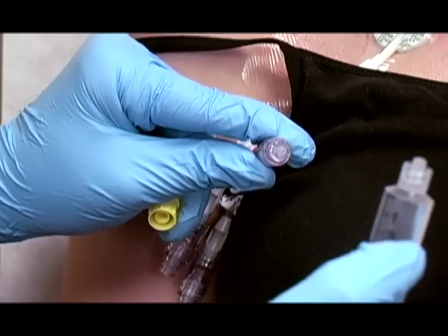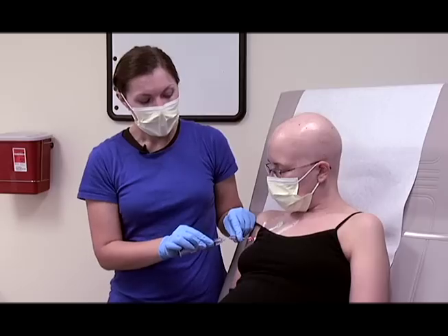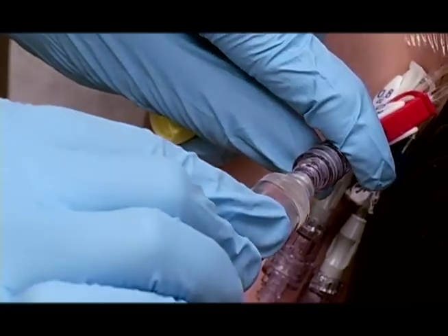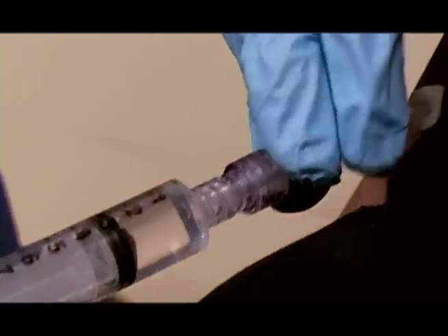Using this needleless system, you will attach the syringe to the line. Holding the syringe in one hand, using your other hand to hold the cap, push the end of the syringe into the cap and turn clockwise until the syringe is securely in place.